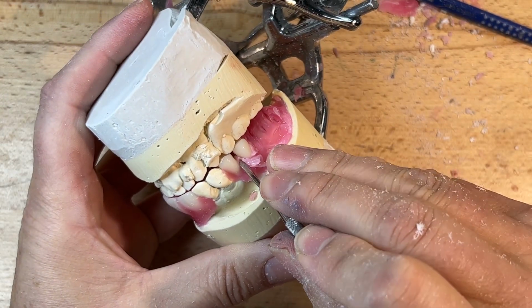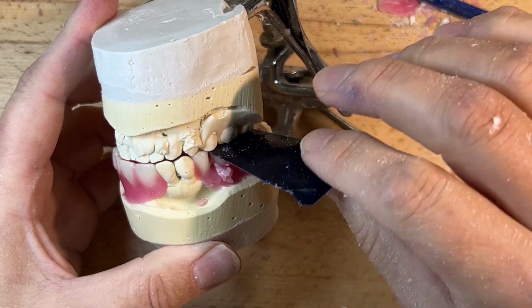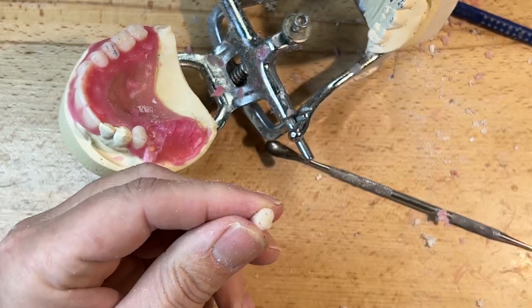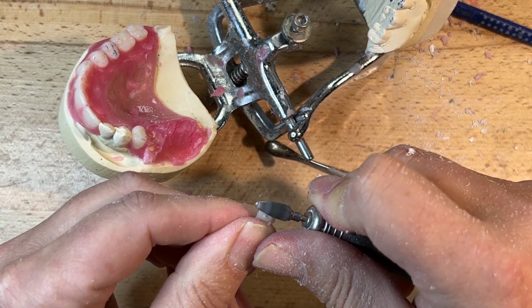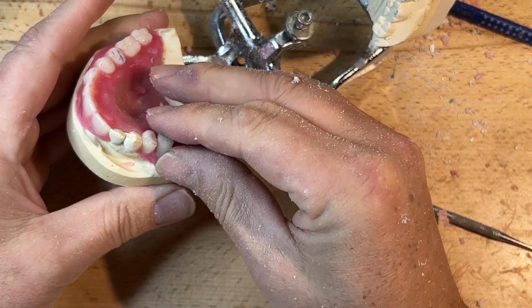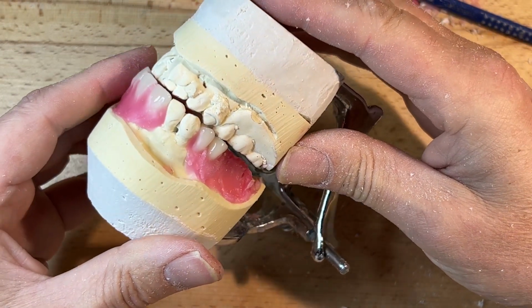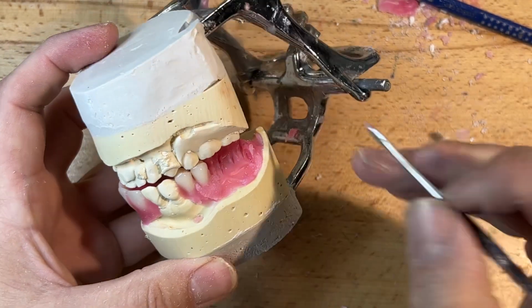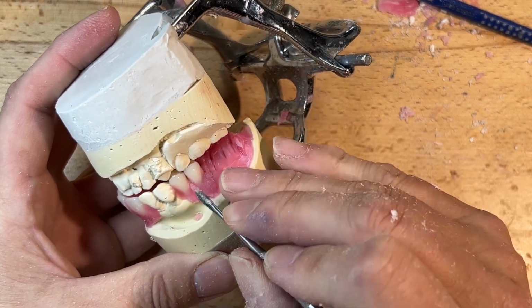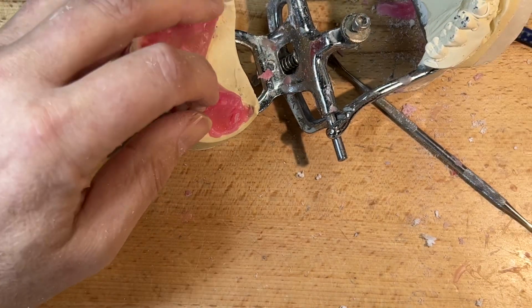Not the happiest with this one here. Again, this 5 is causing issues on the occlusion of this one, so I've lost my overbite. So I'm going to have to create it from this occlusal table. Number 5, reduce it. Try not to make it look too flat. You can see it's hitting here on the mesial side because I'm slightly a little bit more anterior, which is fine. I don't want to go back over here onto the hamular notch in occlusion. I mean, this is ridiculous to go that far back.